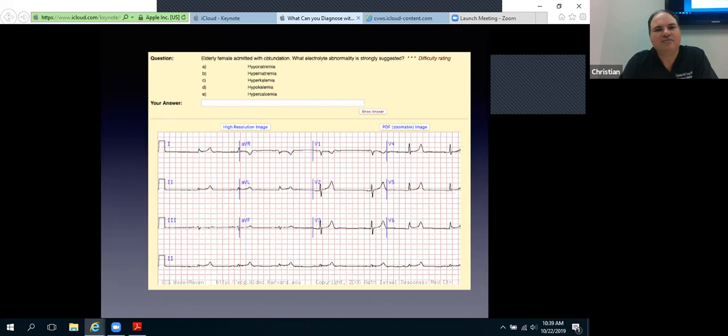How do you explain the low amplitude of the P wave? She's old. Was she obese or COPD? This doesn't look like COPD to me in particular, but she may be a large person, because we are seeing low amplitudes in all the limb leads, so it's suggestive of that.